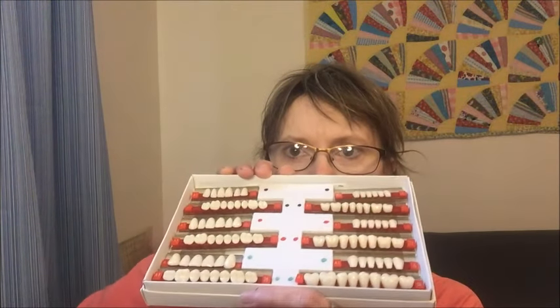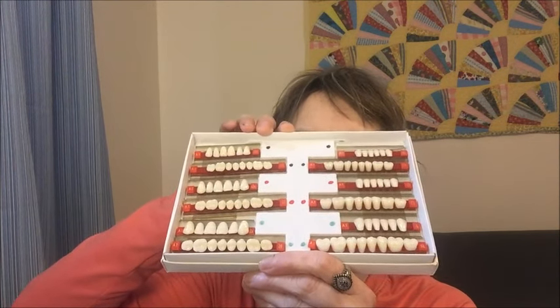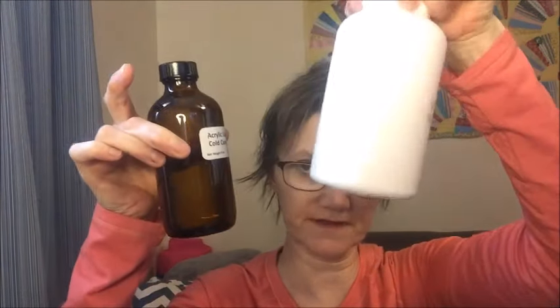You do need some specialty items. You need a flask, base wax, and this is a Dremel kit I bought off Amazon. You also need plaster, impression trays, and teeth — they come in small, medium, and large. I got the A1 color resin teeth. You also need acrylic powder and cold-cure acrylic liquid — that's what dentures are made of.